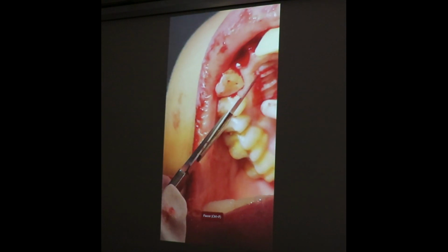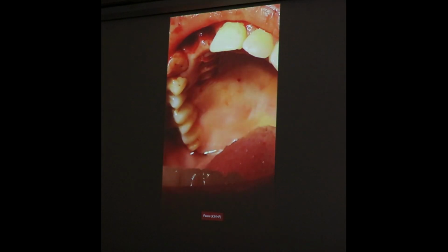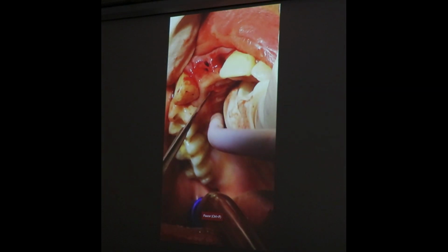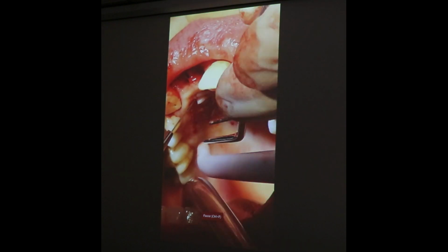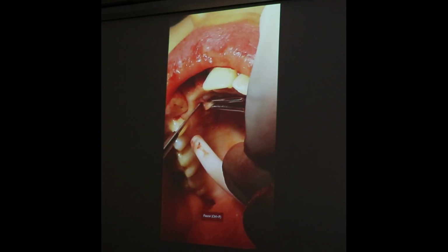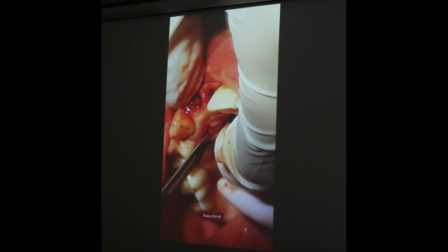Now remember, this patient has already had orthodontics, implant placement, and the first soft tissue graft, and till today nothing after that. So we tried to the maximum to avoid more surgeries. But we found in the long run, probably this area is going to look more unaesthetic, because I saw the soft tissue was slightly running away.